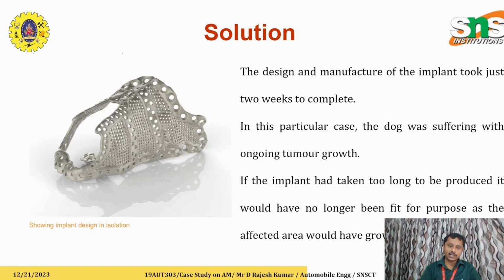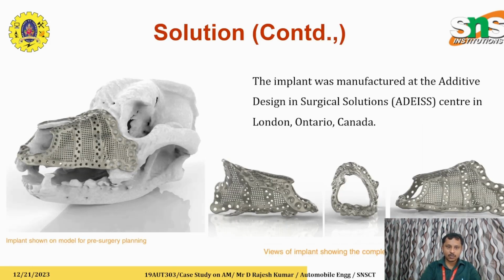Here they used 3D printing technology, where the dog's upper jaw is measured using a 3D scanning device, the CAD model is created, and the design is ready within 2 weeks. This is the implant which was carried out on the dog.